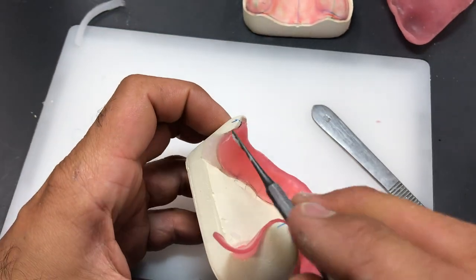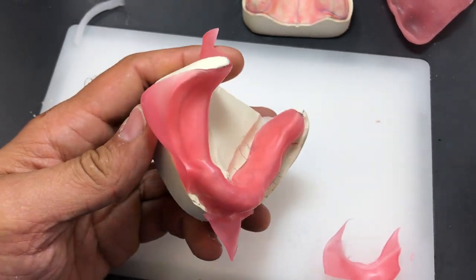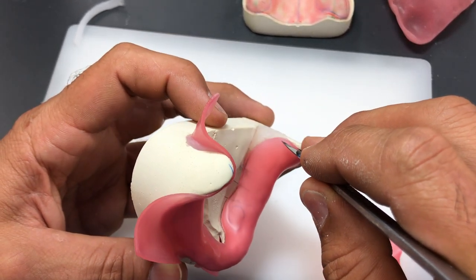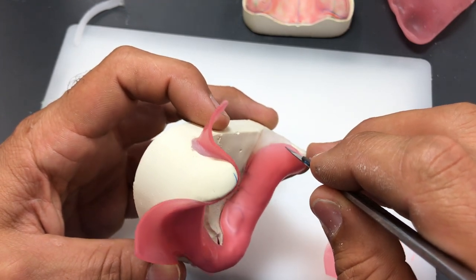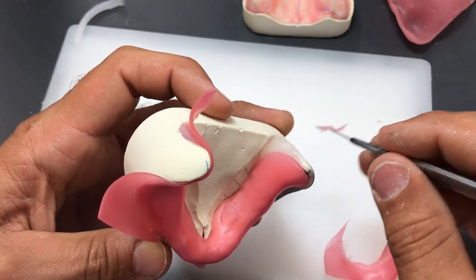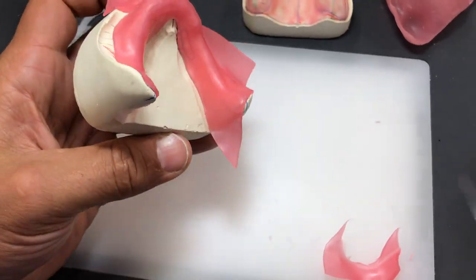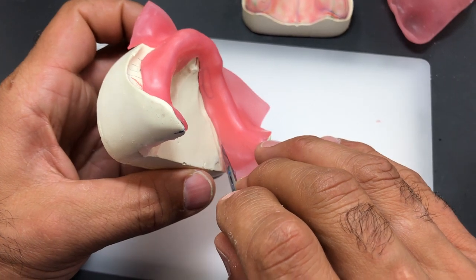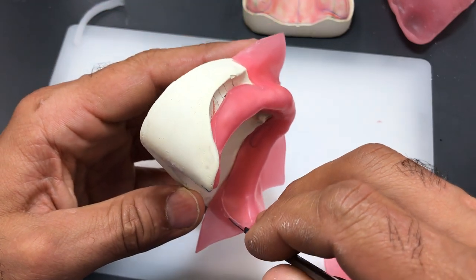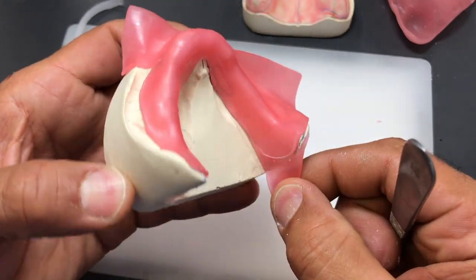So back here, this is a bit of a guesstimation on my part, where I think the custom tray is in relation to that line. But I think I'm fairly close. Finish off the other side. Right side is anchored to the left. My left side is rotating, and it creates a nice precision cut.